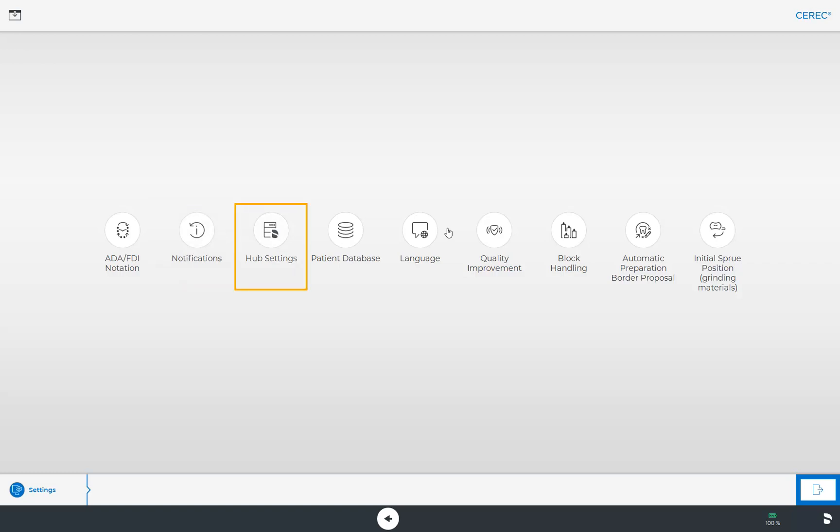The third option concerns the hub settings. Here you can determine the settings for the server connection or check the connection status.